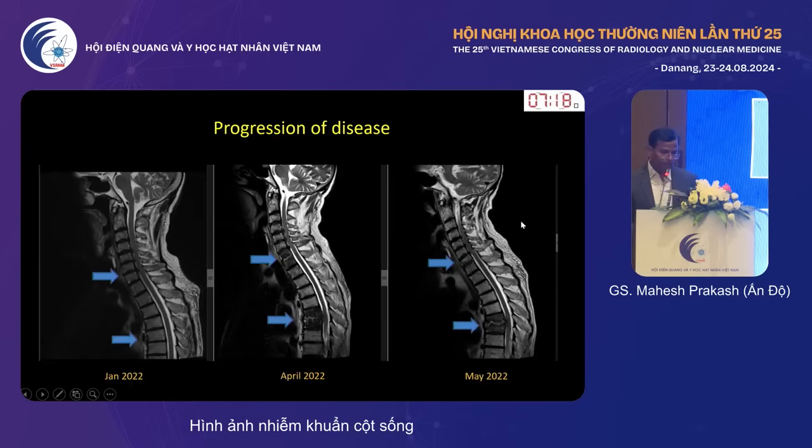In some cases the patients have symptoms, but on MRI you can't see anything. Those patients we must follow up, because sometimes the changes on MR are found in later stages.